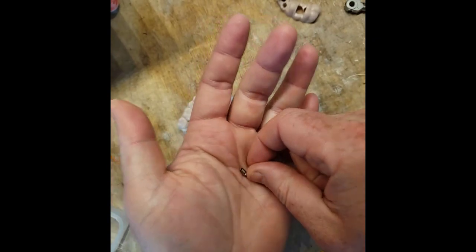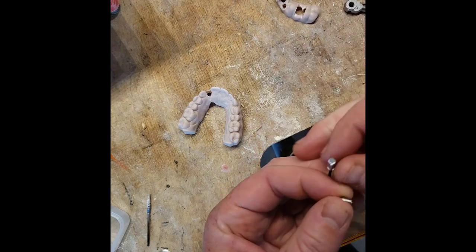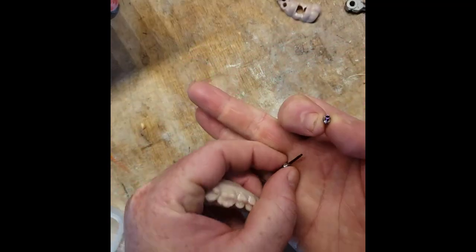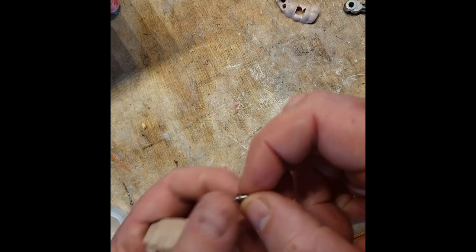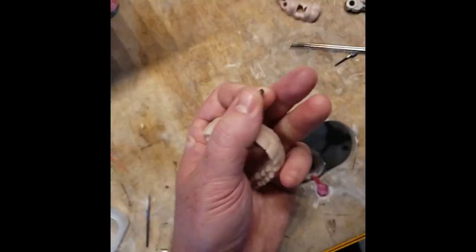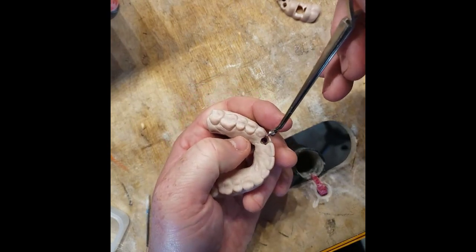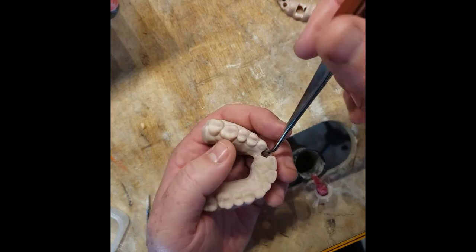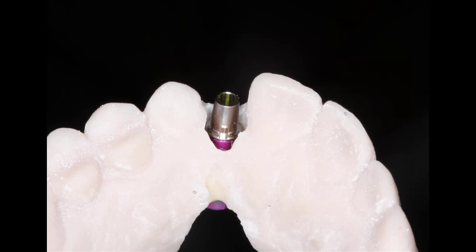This working model allows us to go ahead and put on the engaging angled tie base. The screw that goes into this is different from most abutment screws — you can't use it interchangeably with just any random tie base screw; you've got to use the one for the angled multis and the ball tip driver we sell, which is the only one that can screw it in off-axis. The notch is oriented towards the lingual, and it dropped in perfectly — the notch is perfectly oriented exactly the way we had it digitally.